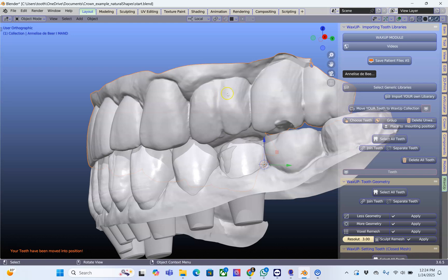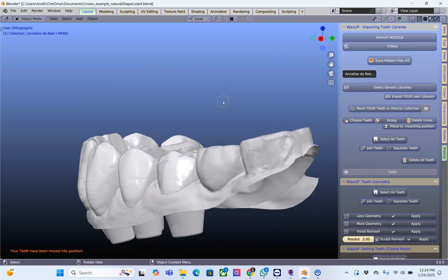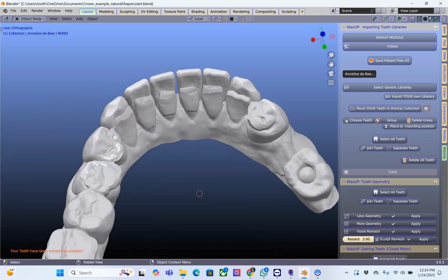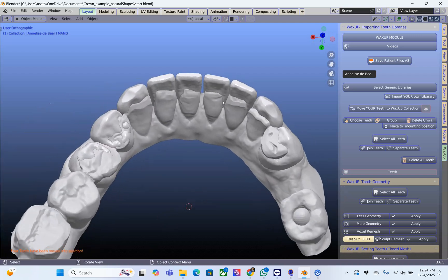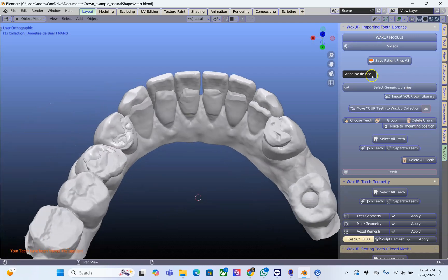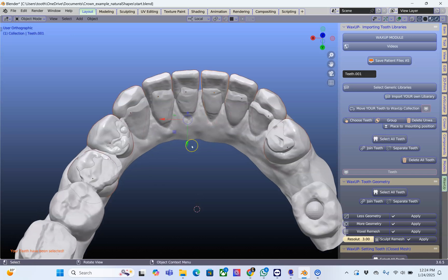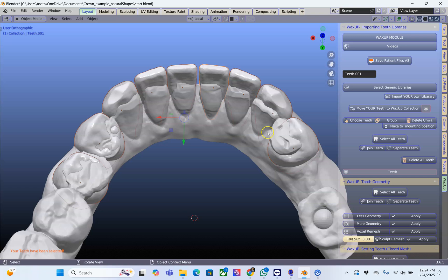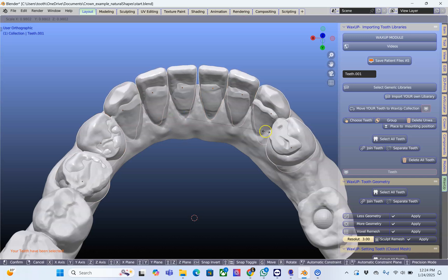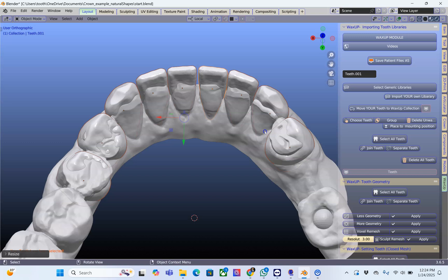I'm going to select the top model, click on H to hide it, then look at it from the top. In the wax-up module we can select all teeth by clicking on that button. Here maybe they are a little bit bigger — I'm going to use the S key to scale them down a bit, and we're actually very close to where we need to be.